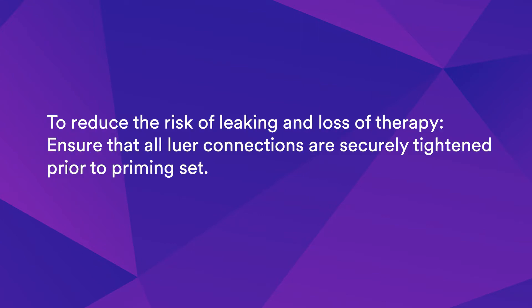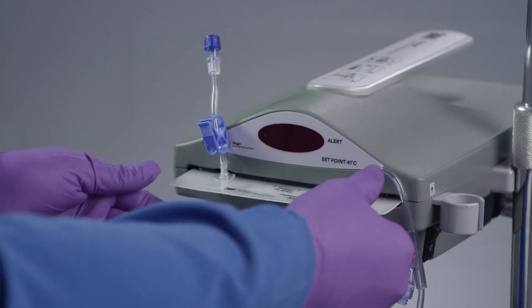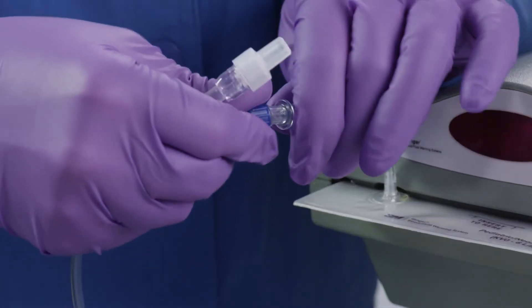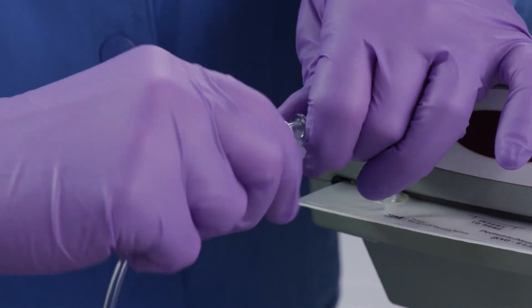To reduce the risk of leaking and loss of therapy, ensure that all luer connections are securely tightened prior to priming. Before priming, slide the fluid warming cassette into the slot in the warming unit. Connect the inlet line on the Blood Fluid Warming Pediatric Set to the fluid source.